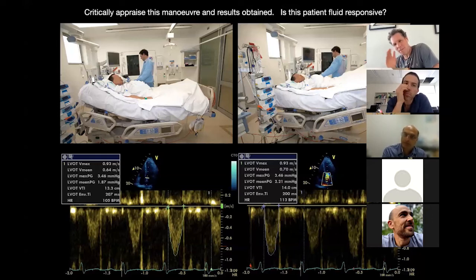For me, I normally have that E wave is actually more about telling us when we've had enough fluid. If you've got an E to A ratio of, say, 0.8, but then you give the fluid bolus and it goes to 1 to 2, that tells me, because it's a fluid dependent or load dependent measurement, that if you see an increase coming up, you're starting to get increasing left atrial pressures. And that tells you that you've given enough fluid.